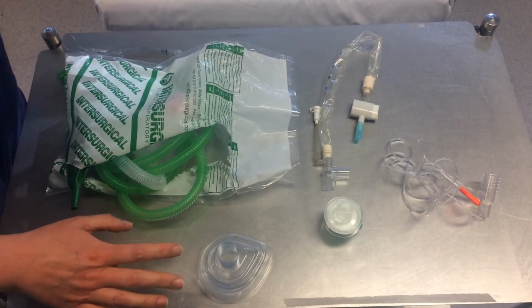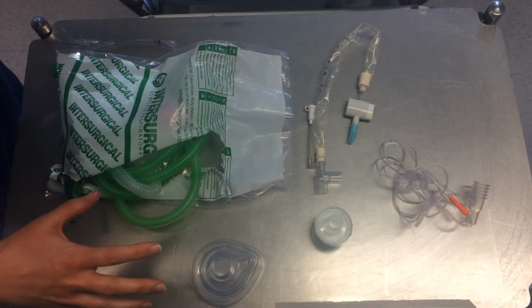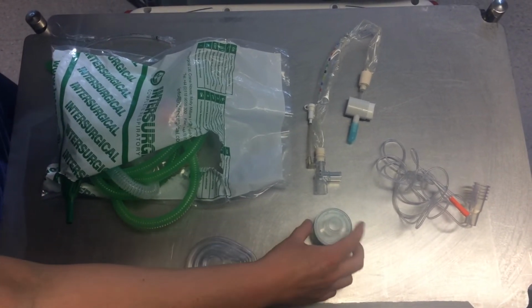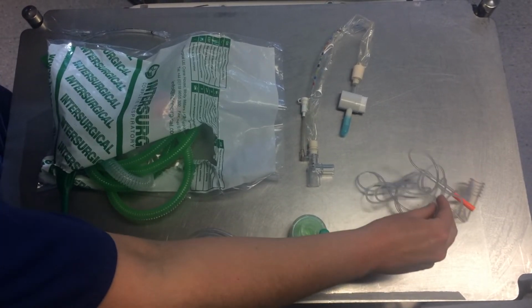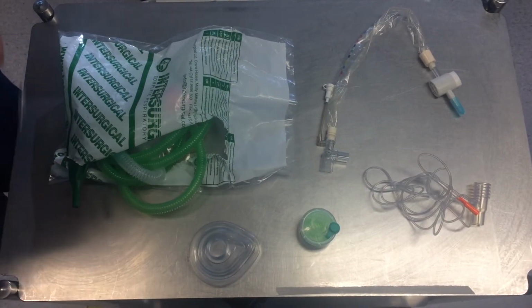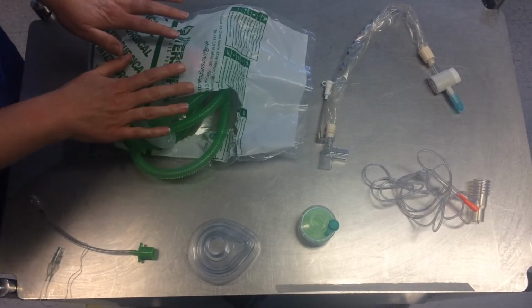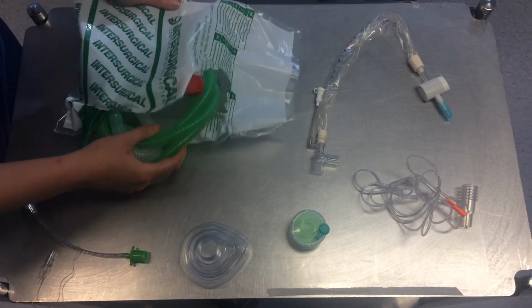So for our COVID intubation setup, for the airway circuit, we need a face mask of appropriate size, HME filter of appropriate size, end-tidal CO2, inline suction of appropriate size, a cuffed tracheal tube, and an AIRS T-piece. To set this up, the first thing we're going to do is take this out of the bag.